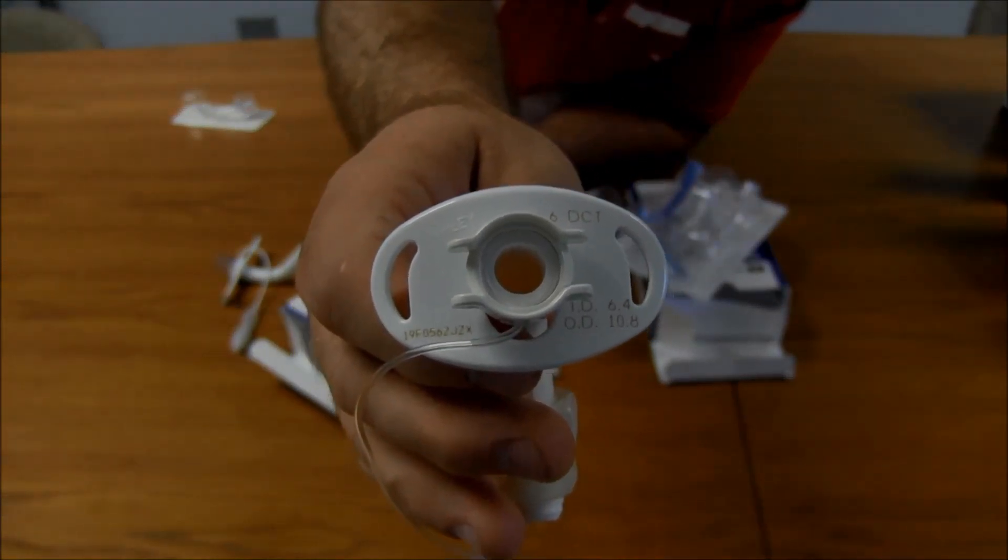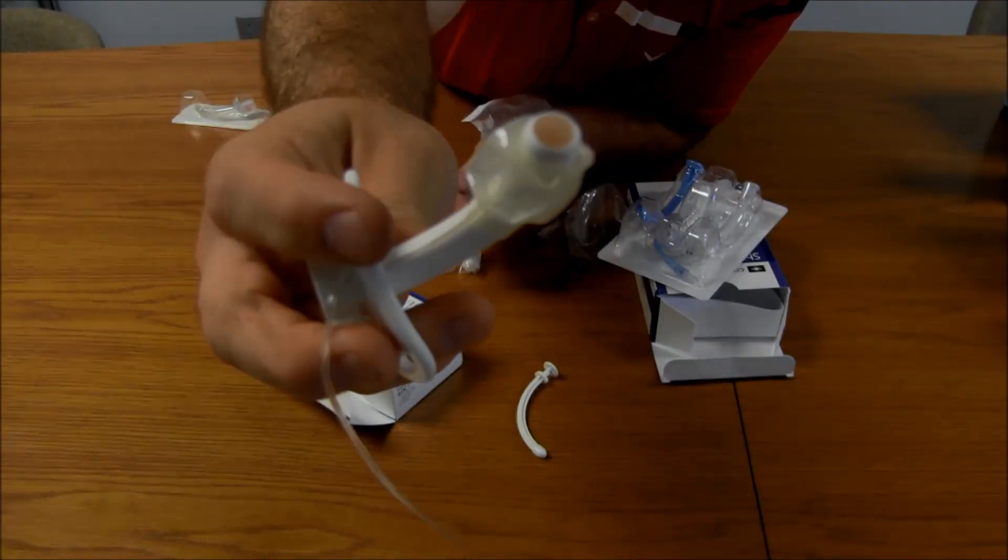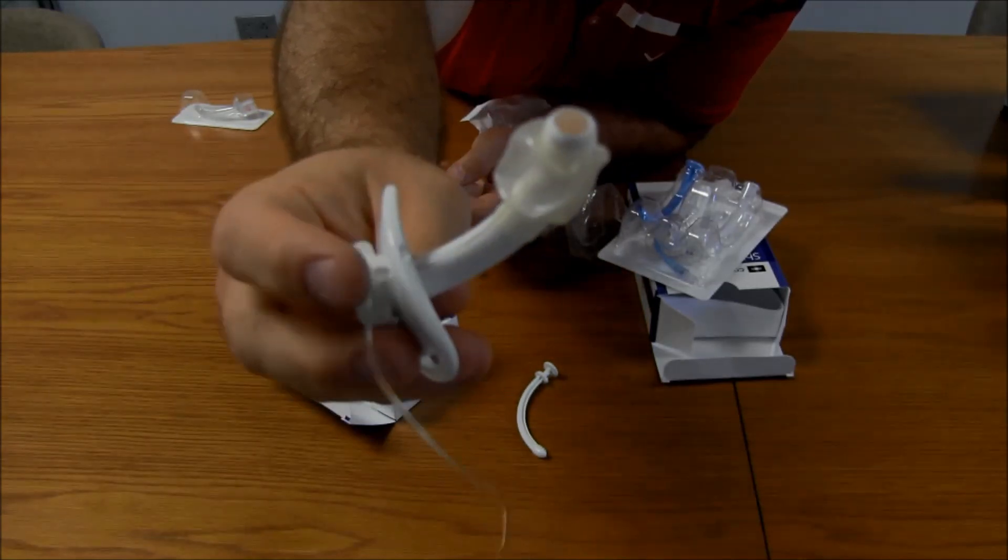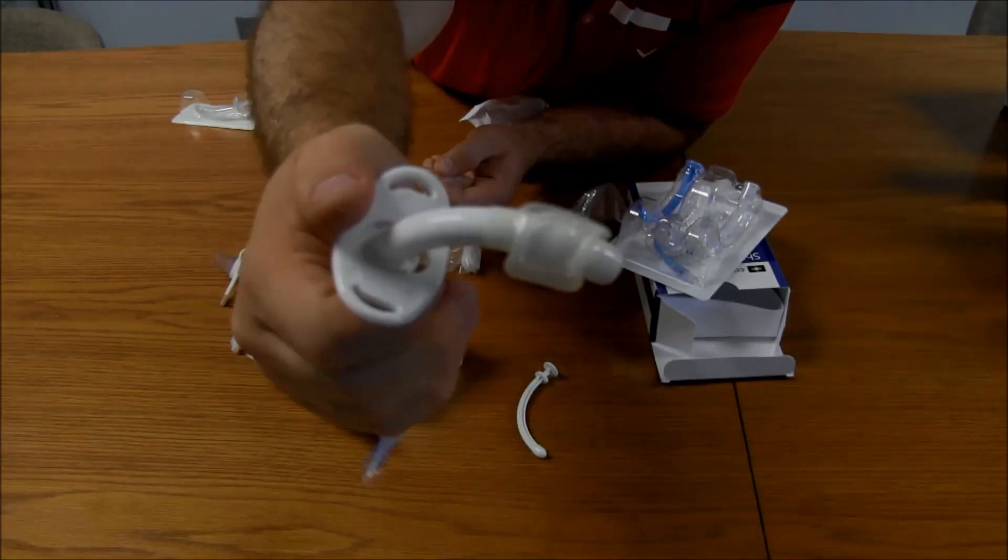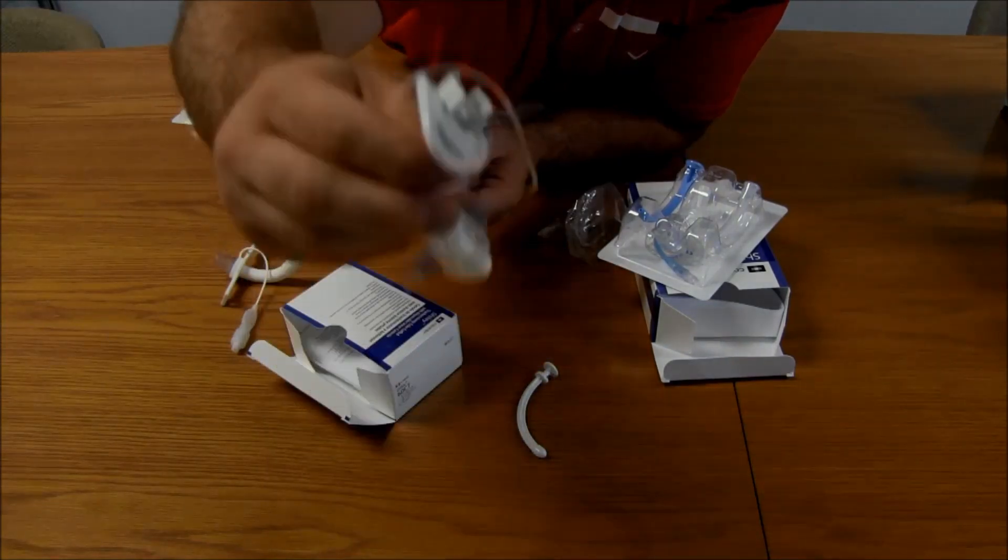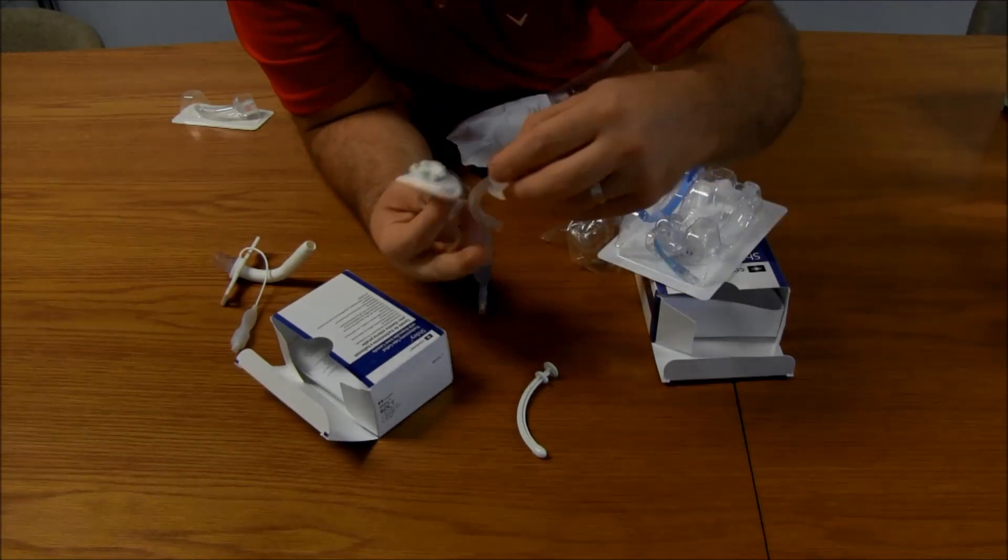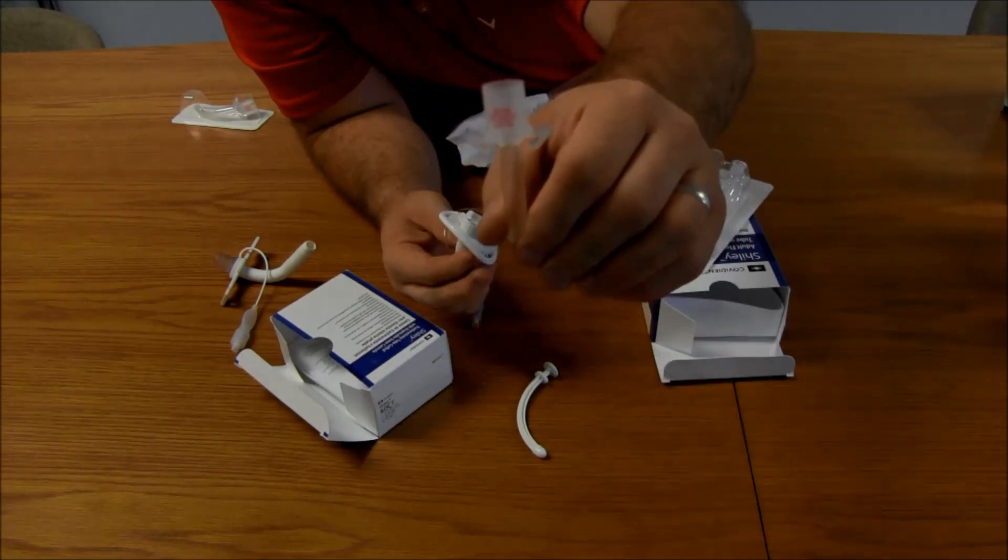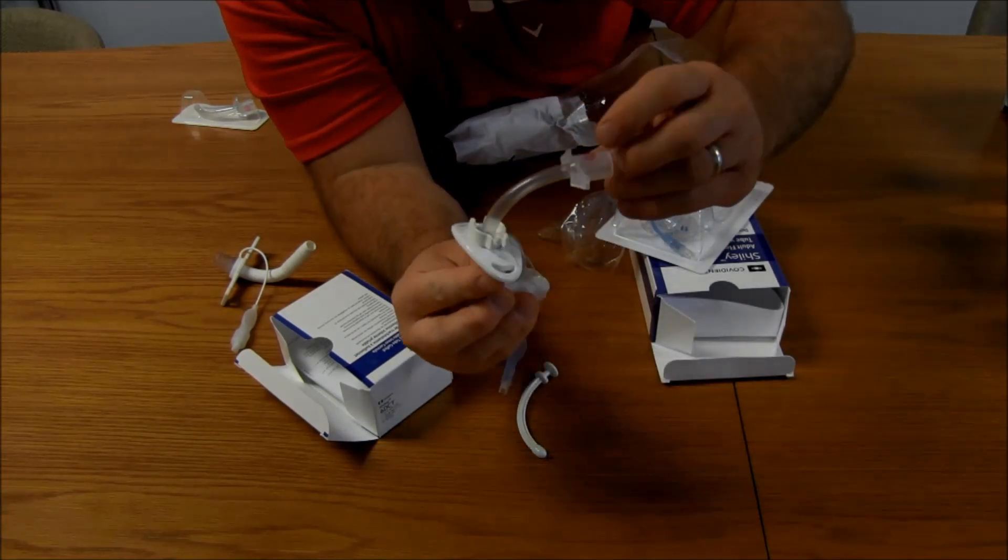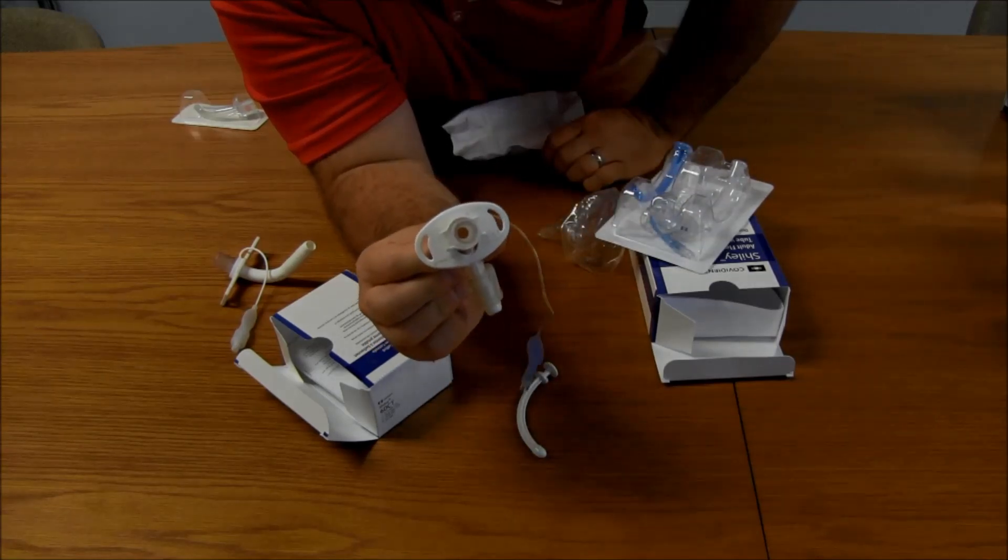And then on this side, we have one of those high volume, low pressure cuffs. So, high volume, low pressure decrease any kind of damage to the trachea. We do have an air cuff with that. And then also, we have the inner cannula. Now, notice the inner cannula with this. It has the clips on it. This is the one that clips in.